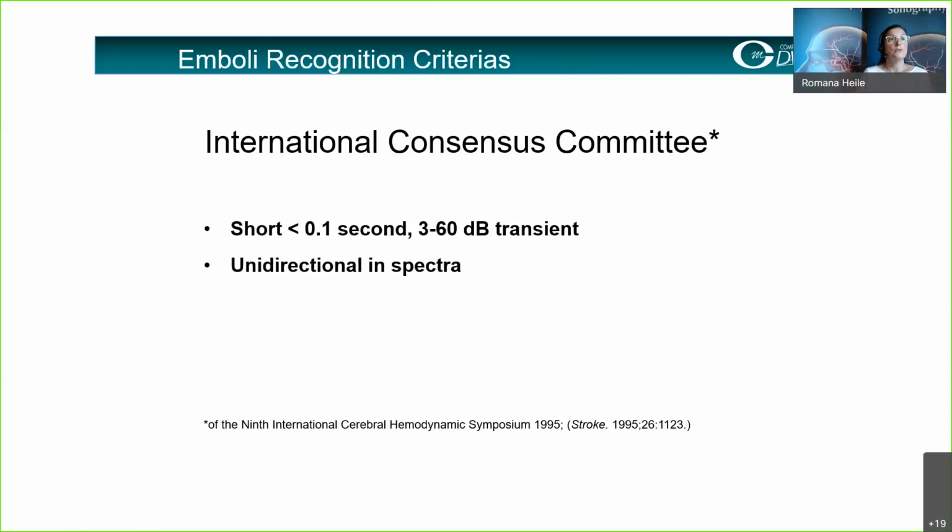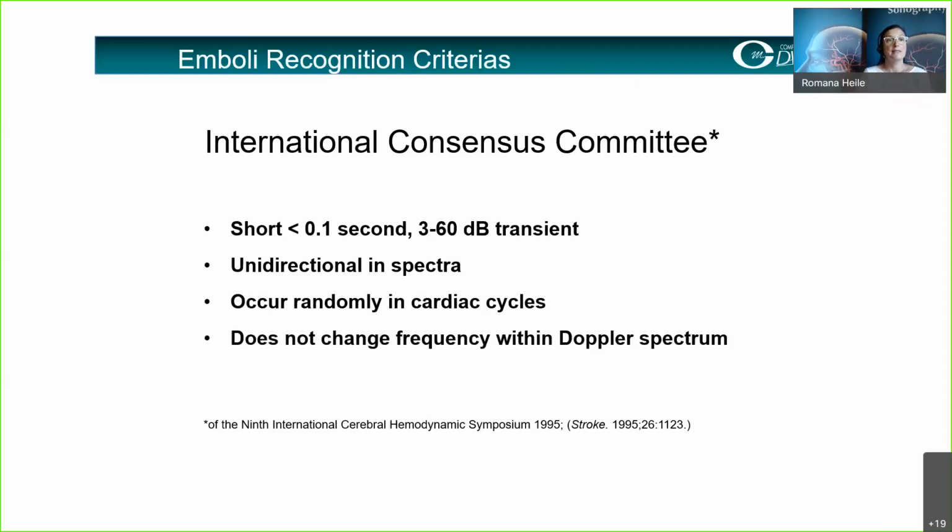It is supposed to be unidirectional in the spectra, meaning it goes in the same blood flow direction as the blood cells that we are looking at. It has to occur randomly in a cardiac cycle, in one Doppler spectra, in one heartbeat cycle. And since it's going with the same speed as the blood cells, because it's also depending on the heartbeat, it will not change frequency within the Doppler spectrum. And again, it has a typical acoustic sound.